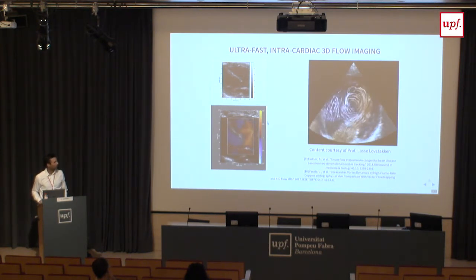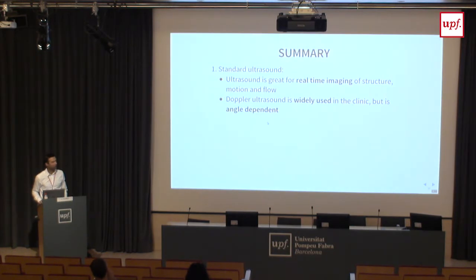So we're getting to my last slide. So I just want to do a summary. Basically, ultrasound is great. It's high frame rate, even standard ultrasound. You can acquire data in real time, at bedside. You don't need any fancy processing to get just simple flow measurements. It has some limitations, such as angle dependence, aliasing, and so on, but it's very widely used. So any small improvement you can make in ultrasound can potentially improve the life of many more people than perhaps any other imaging modality, at least for cardiac care.